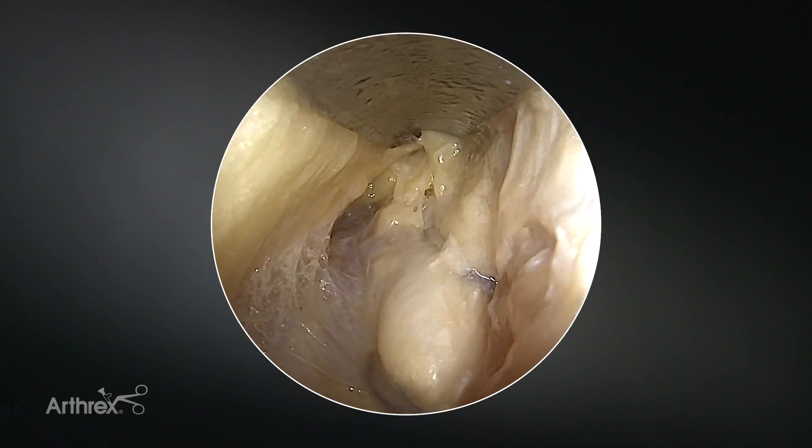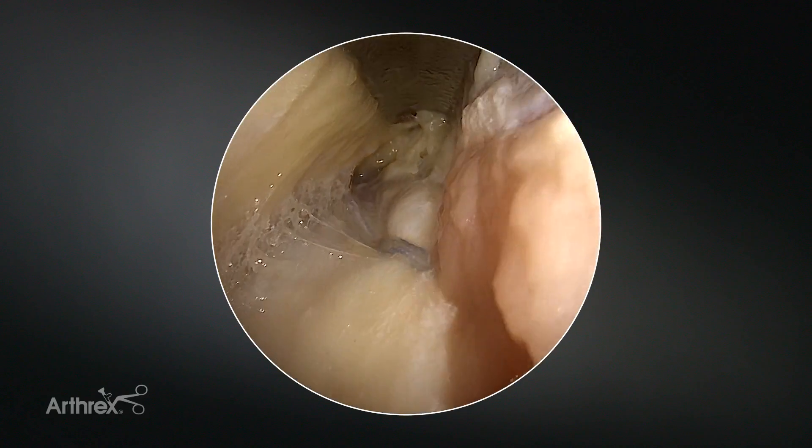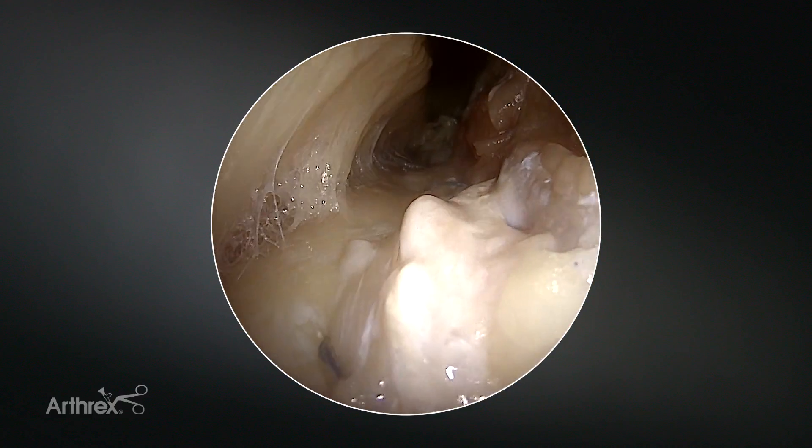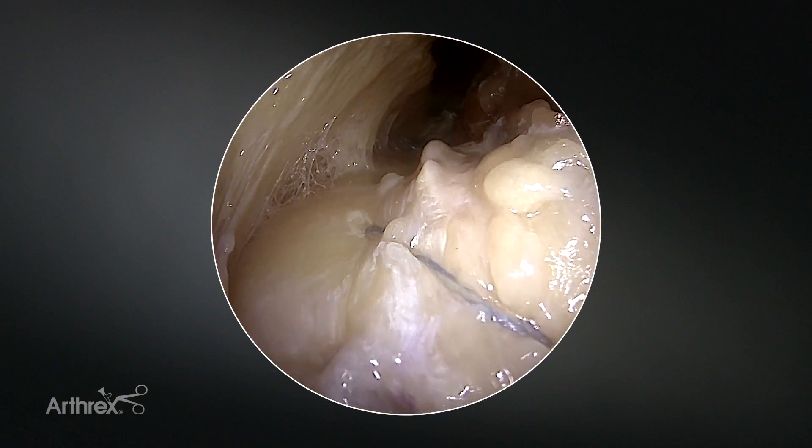We're now looking at our repair with the scope. You can see we've got this beautiful side-to-side repair, nicely re-approximating the quadriceps. It's extremely strong since it's performed with suture tape.